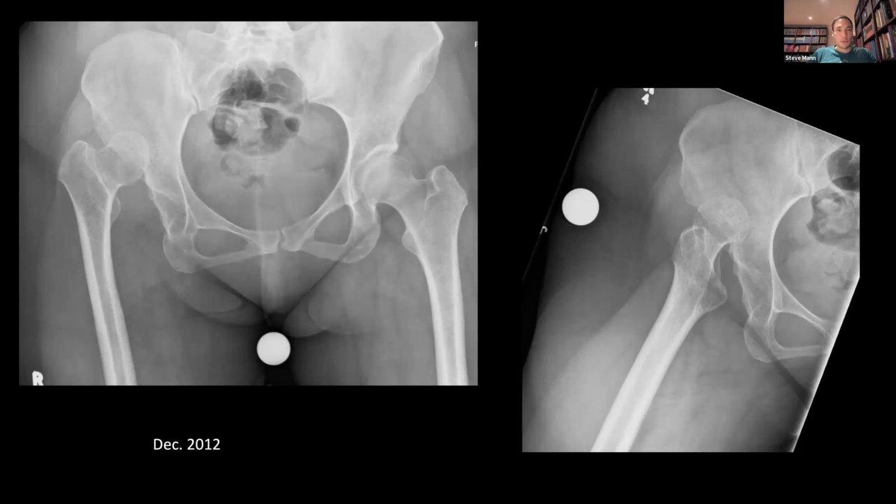Not much to add. I agree with all of that. Again, my go-to implant is a cemented prosthesis for the femur. But I think templating here is key, and making sure you've got kind of plan A, B, C, and the equipment for all of those. Are you going to need an acetabular augment? If you don't have access to assistive technology, be prepared to take an intraoperative X-ray at least to see if you're actually where you think you are in the acetabulum, because it can be surprisingly hard to find the true acetabulum.